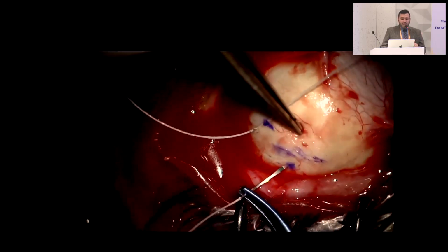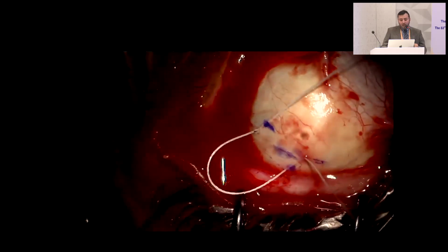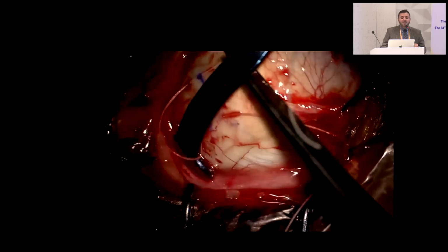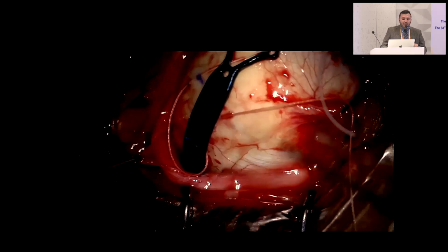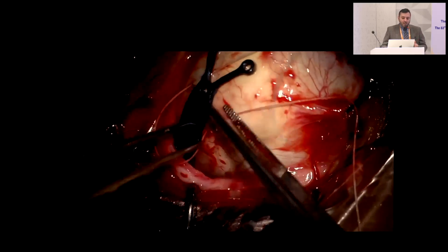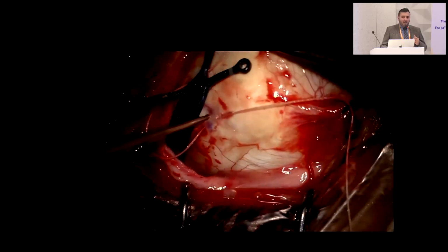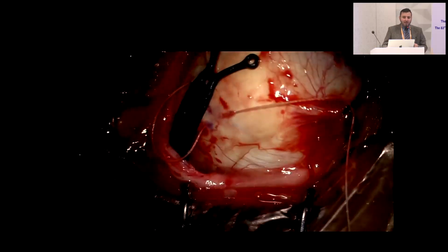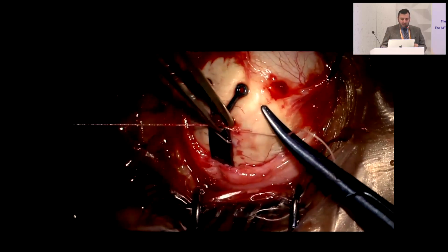It causes a good and strong indentation effect at the posterior pole, as we are going to see now in this part of the video. This is the buckle. It has 2 knobs at the anterior part to be fixated, and we can manipulate it while using, as we are going to see in the video, a chandelier light, and I can see the indentation effect of this buckle, and adjust the plate of the buckle at the posterior pole.